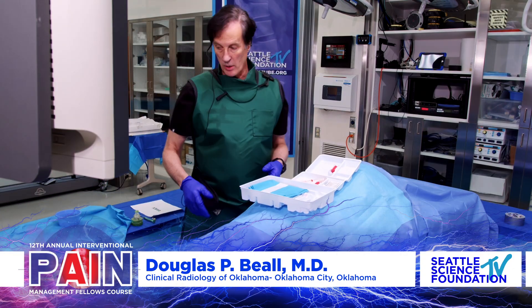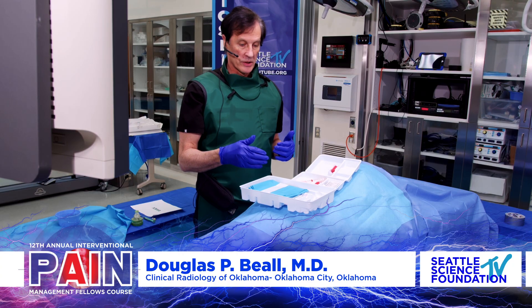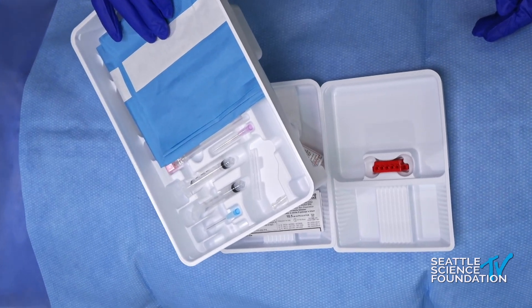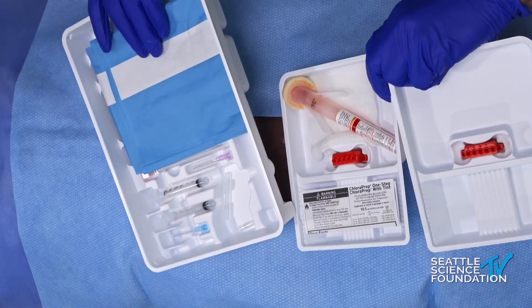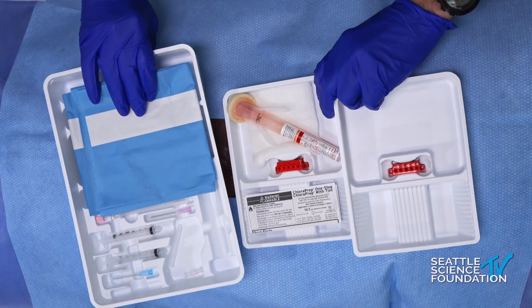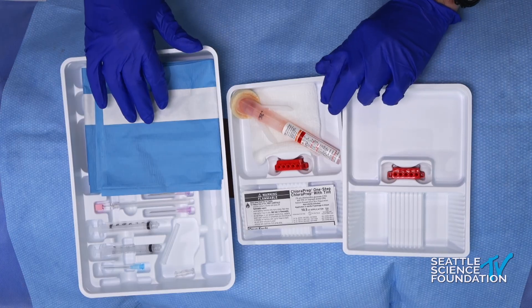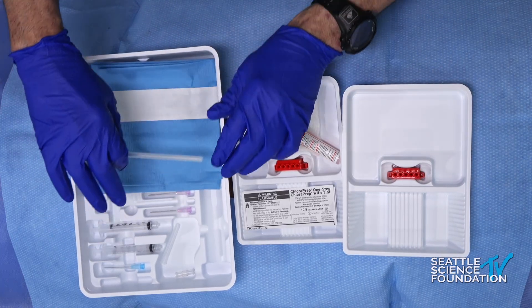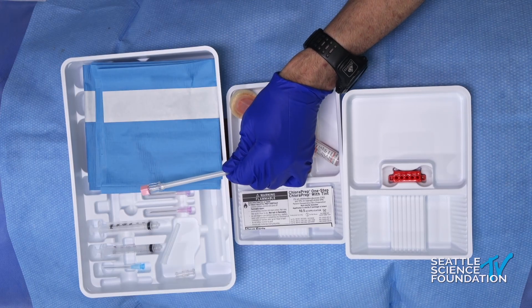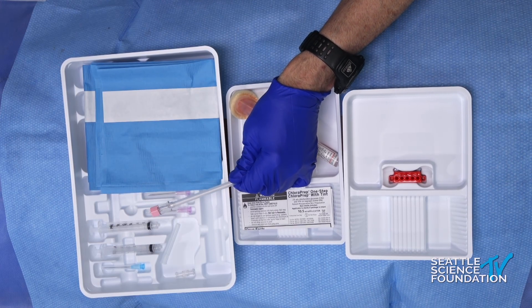This pack from Vivex will come in two packs: a small box containing the ViaDisc, then a larger box containing the sterile prep pack, needles, and everything you need. You don't really need to have anything else — a sterile drape, a syringe to draw it up, a syringe for anesthetic, a 20-gauge needle, and an 18-gauge needle.